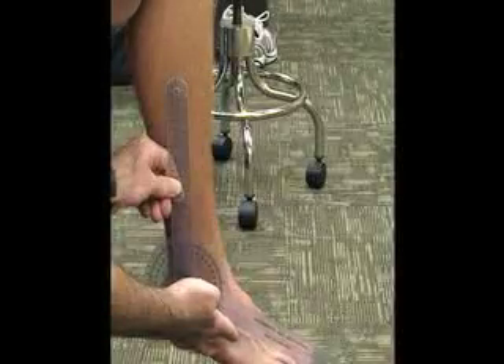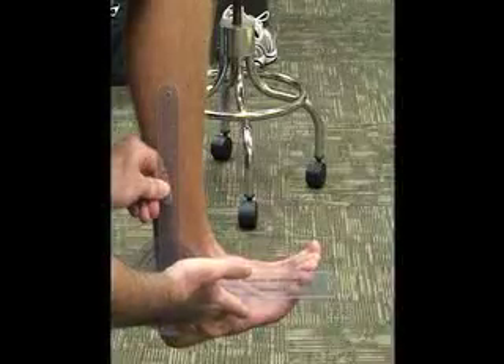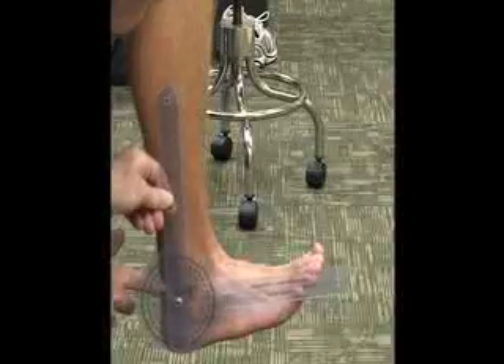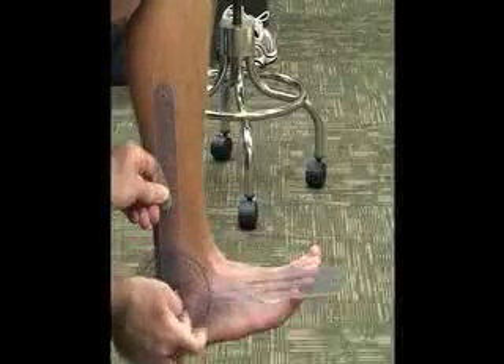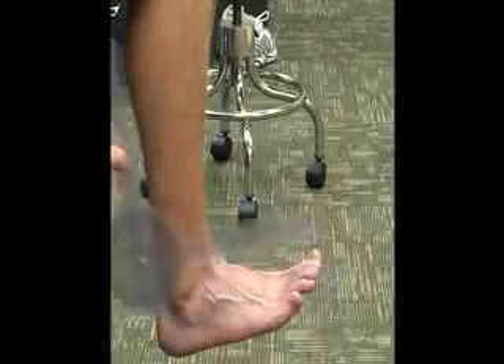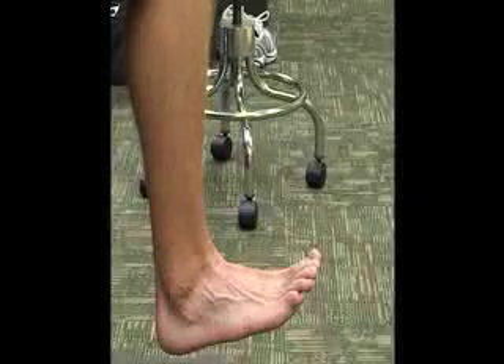Once we have all those landmarks, he's going to dorsiflex — so he's going to come up. We want to check your landmarks to make sure they're all parallel to your fifth metatarsal. Normal movement for dorsiflexion is going to be 20 degrees.